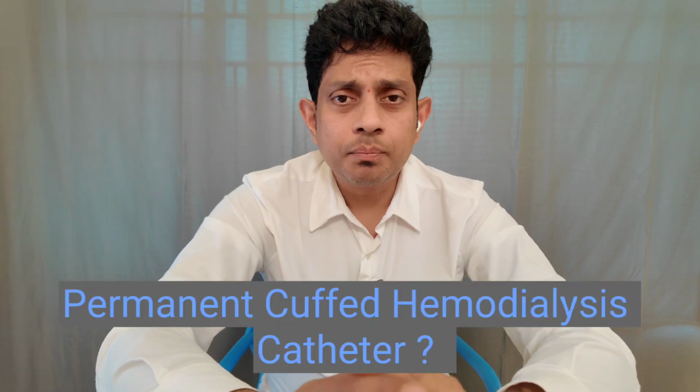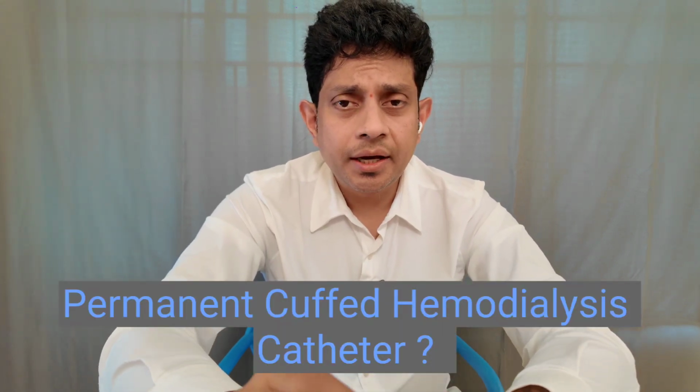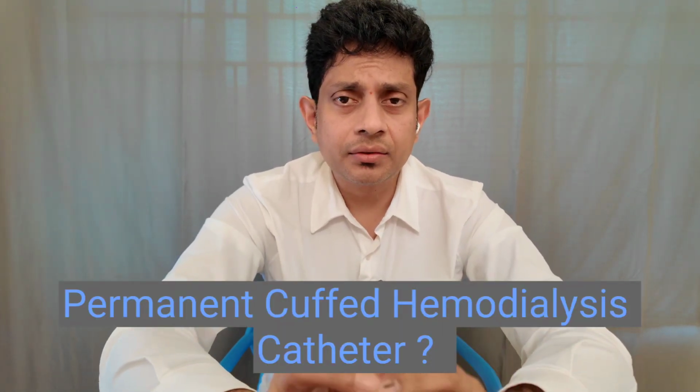So I will tell you what is a permanent catheter. A permanent catheter is a vascular access, and we create a catheterization into an internal jugular vein, or subclavian vein, or the femoral vein. So we create a vascular access for hemodialysis through a permanent catheter. This permanent catheter is like a temporary catheter, but it's longer, the lumen is big, along with the cuff.